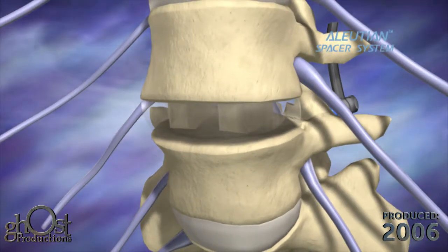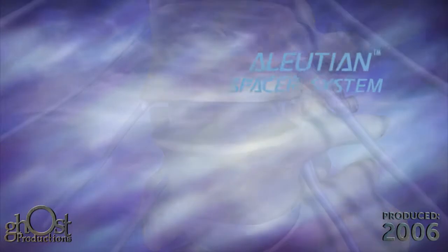The Aleutian Spacer System from K2M, surgeon-driven design.